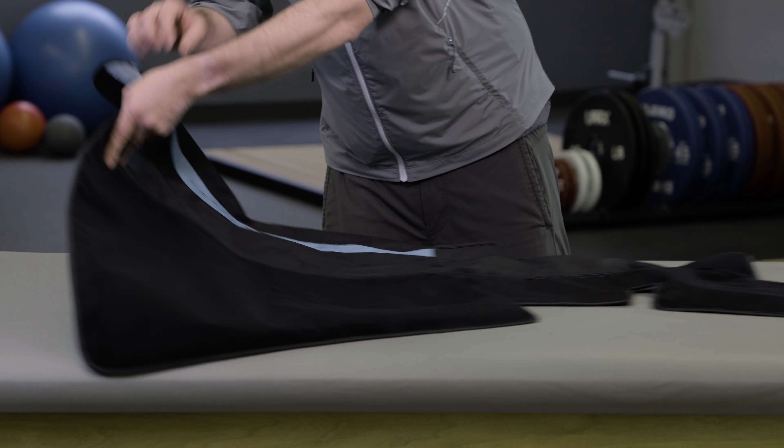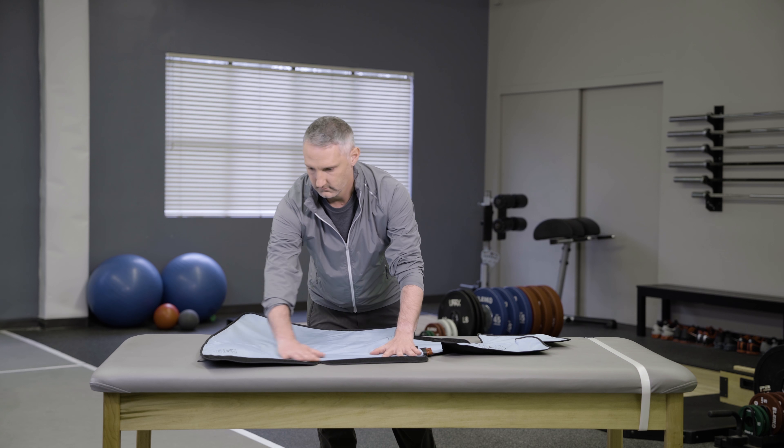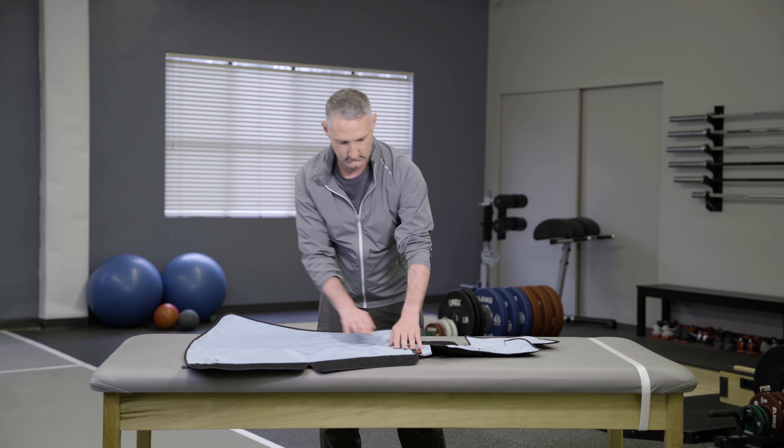After assembly, flip the wrap over with the blue side up and ensure the heat exchanger is uniformly laid out and smooth inside the sleeve.